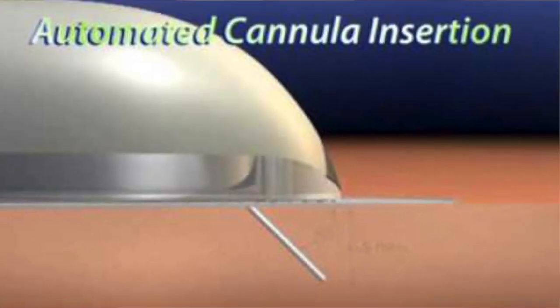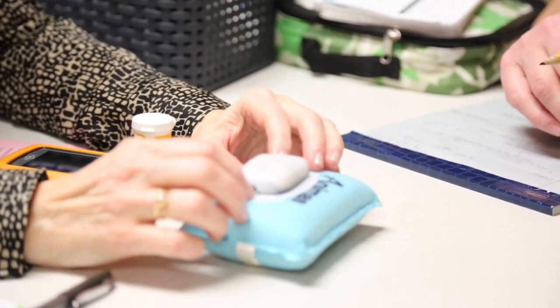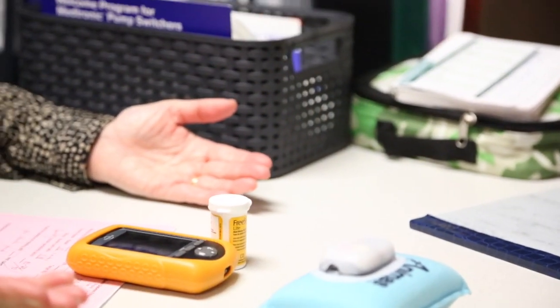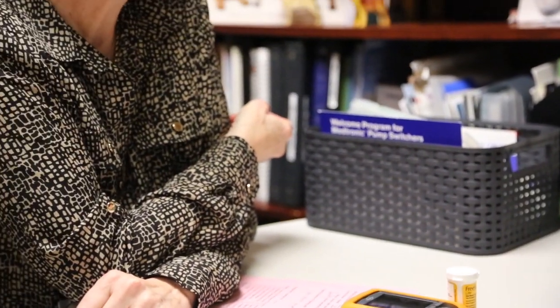Can you see that little cannula in there? It's a little blue line. See a little blue line in that window? Yes. And that's what delivers insulin. And that's a pretty important part of this whole thing. Wow. But the needle itself goes in and out. When you give yourself an injection now, the needle goes in, and how long do you keep it in place? Seconds. You keep it in place for a count of 10. With this, the needle putting the cannula in is not in that long. It just goes boom, boom.